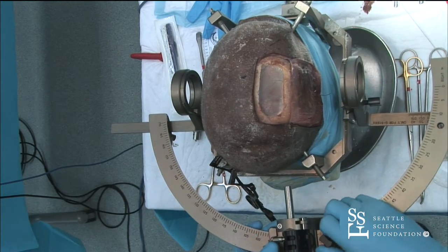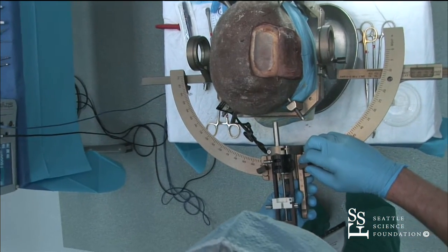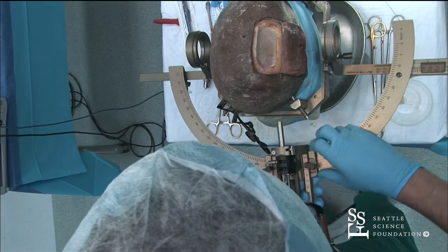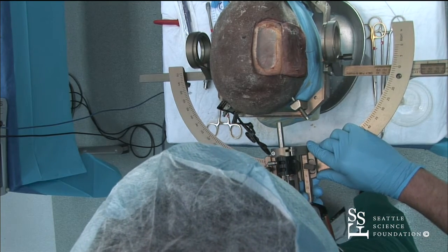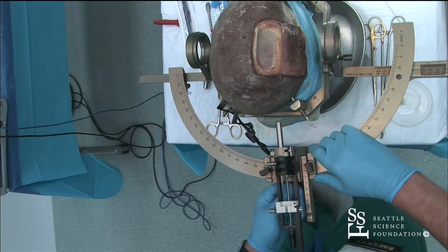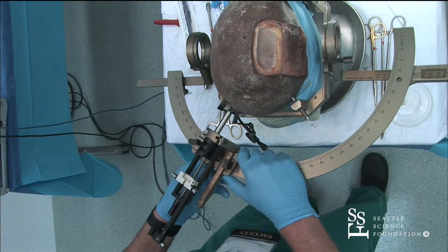And this is a little bit different than most DBSs because you're coming from such a posterior perspective, and you don't have to pick ACPC at all. We're not using ACPC coordinates, so there's no reason to do that ACPC on your targeting.